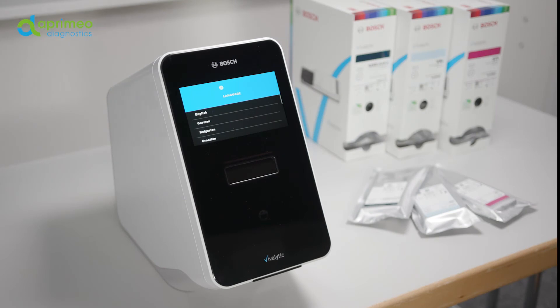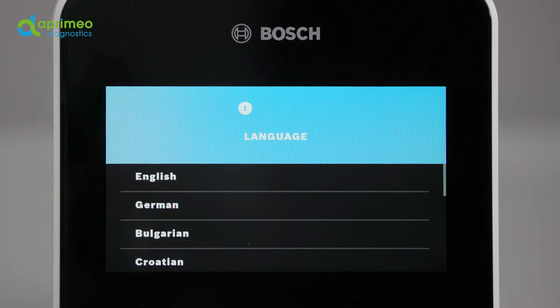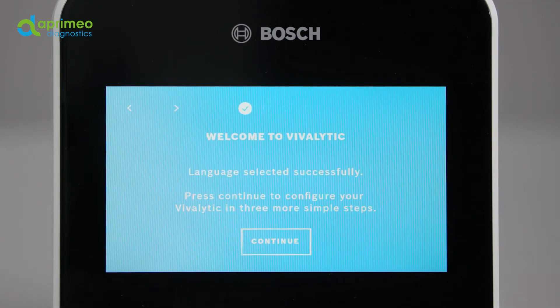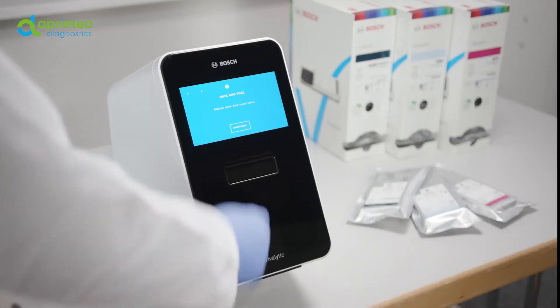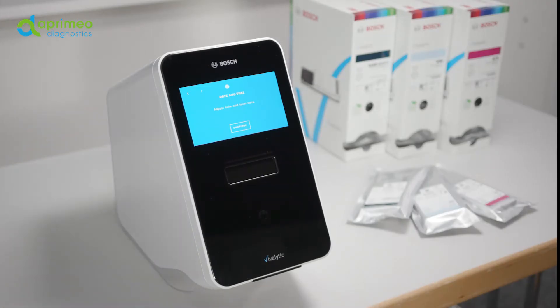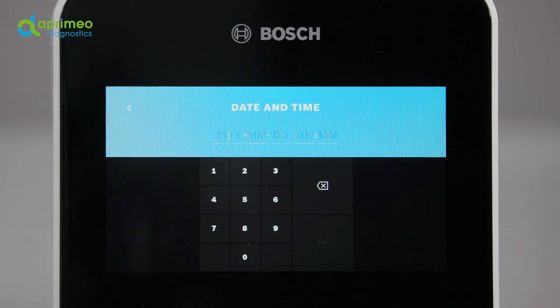When first starting your analyzer, you are guided through a setup configuration. Just follow the prompts on the display. Select a language. Set date and time.